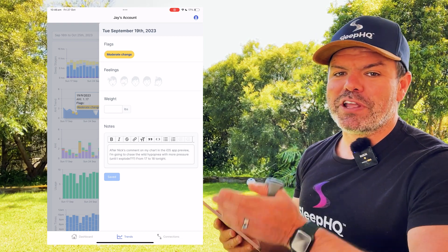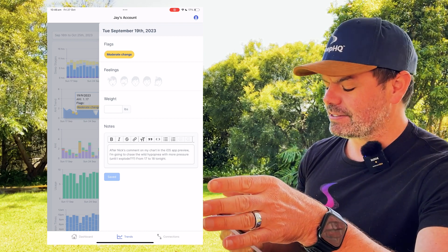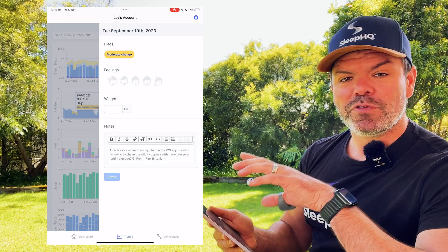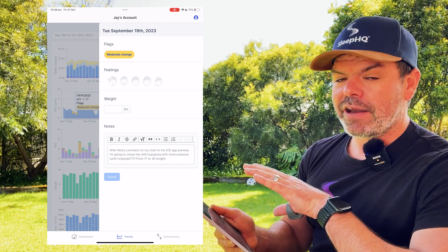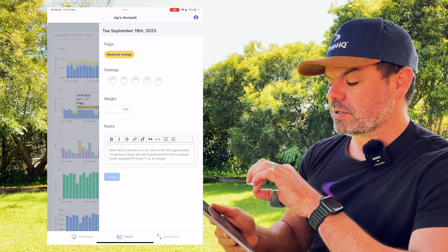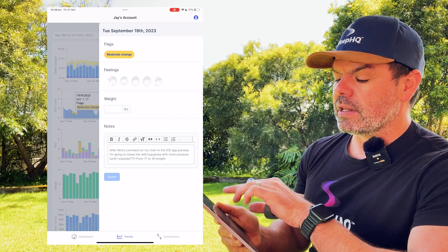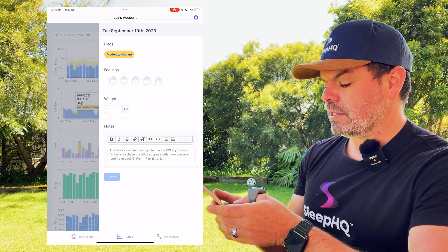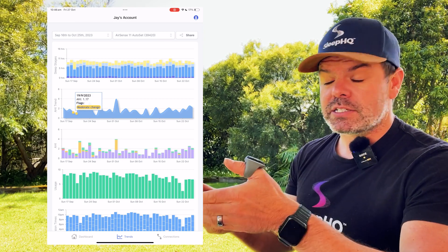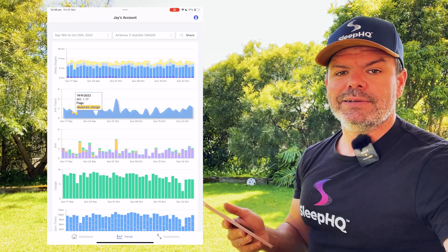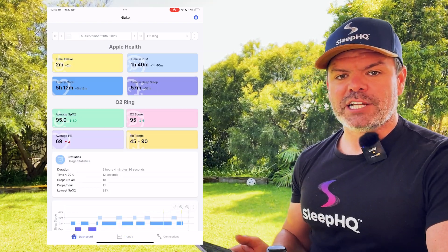In a previous video I was picking on Jay a little bit with some of his hypopnea flags. He watched that video and he's made a little flag here — and that's something you can do. This is Jay's journal. He can add flags, do custom notes, monitor his weight, and click little emojis about how he's feeling on that particular day. It allows you to track your changes to therapy — if you're going on holiday, if you've got a cold, whatever it is, you can track the changes.